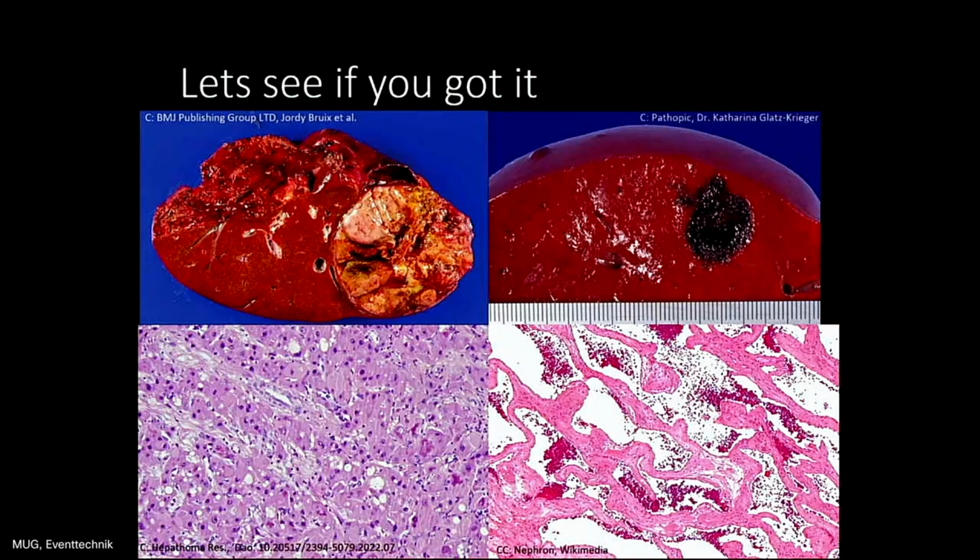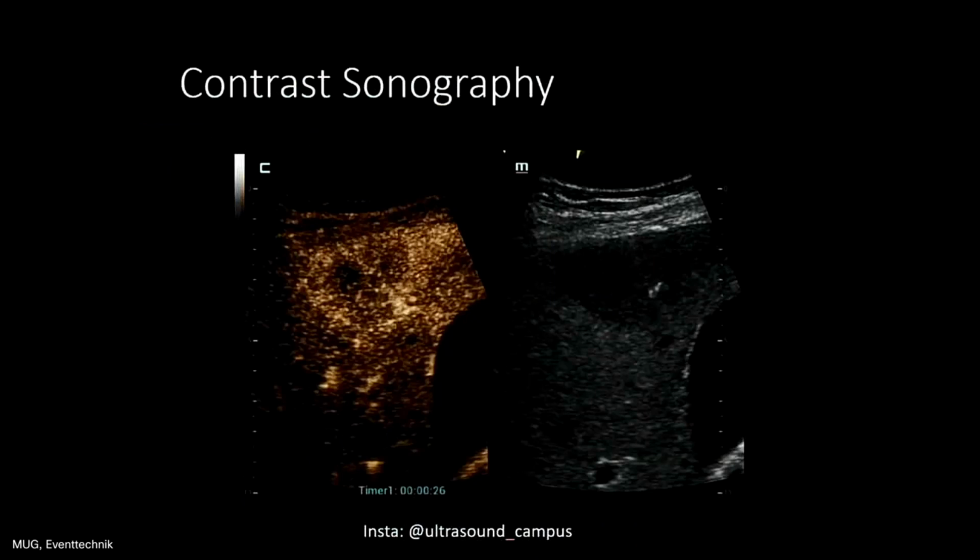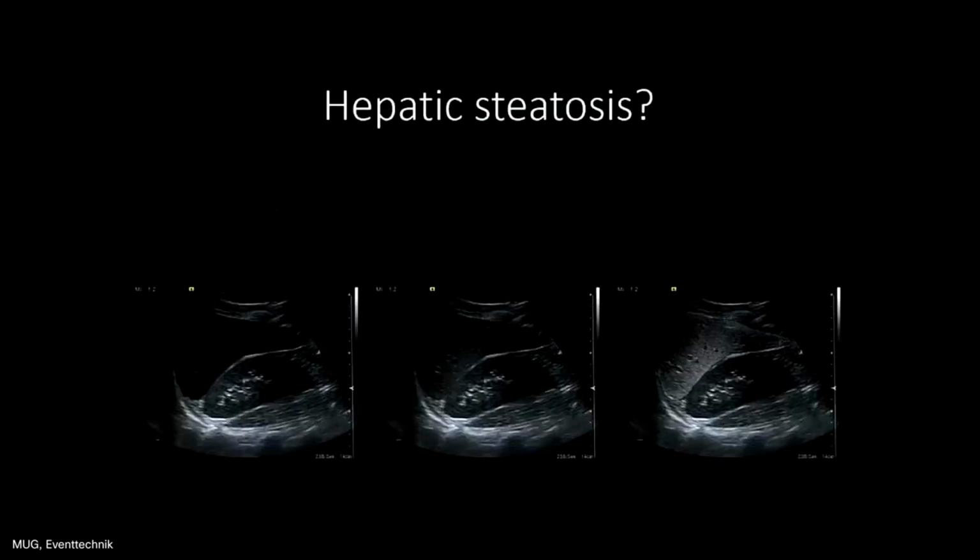That's why in sonography, the hepatocellular carcinoma would not be so different from the healthy hepatic tissue. And you would actually need other modalities with contrast agents, or you could also do an ultrasound scan with contrast agents to diagnose the hepatocellular carcinoma. But that's a topic for another talk.